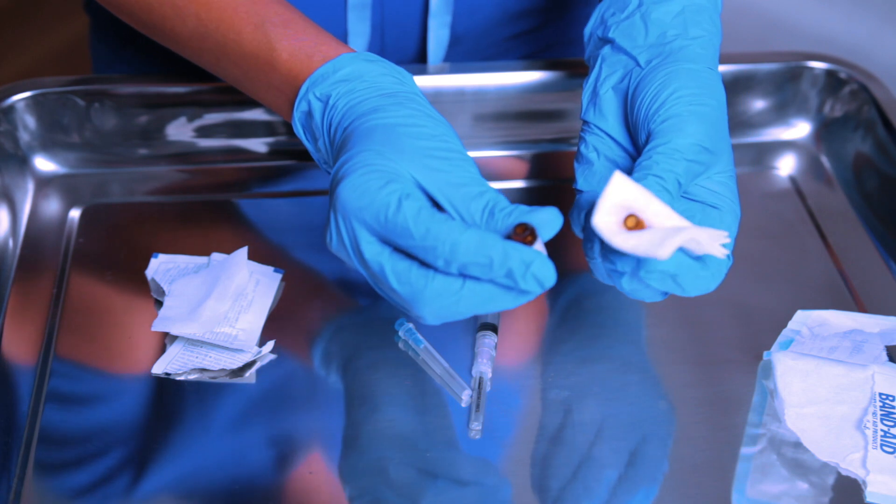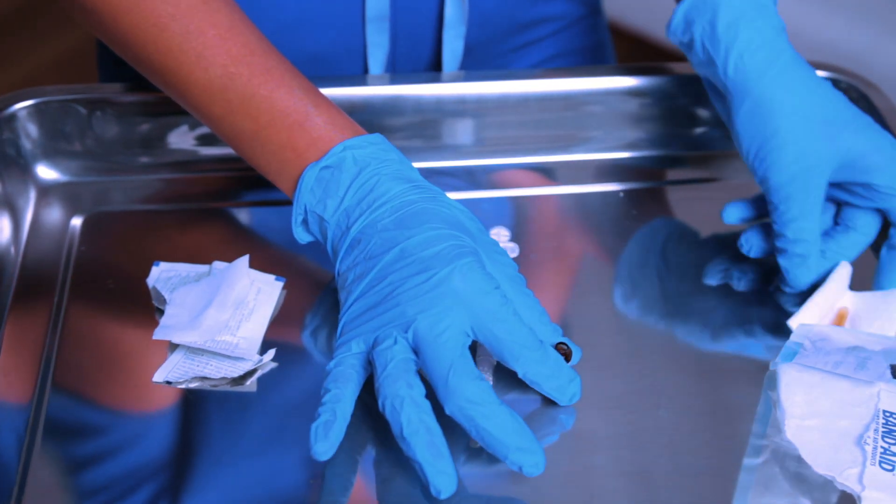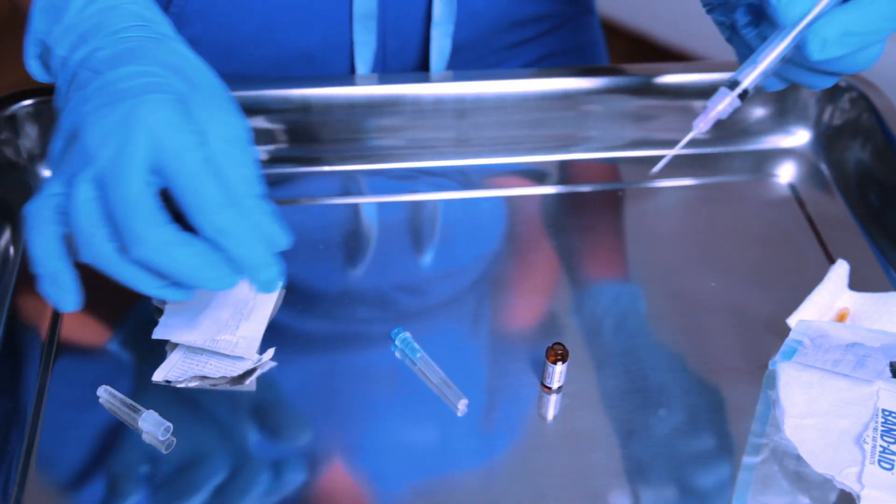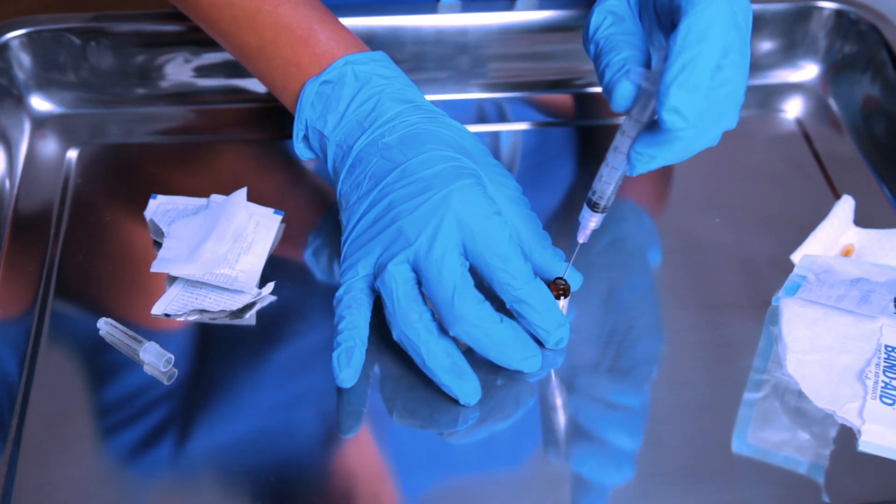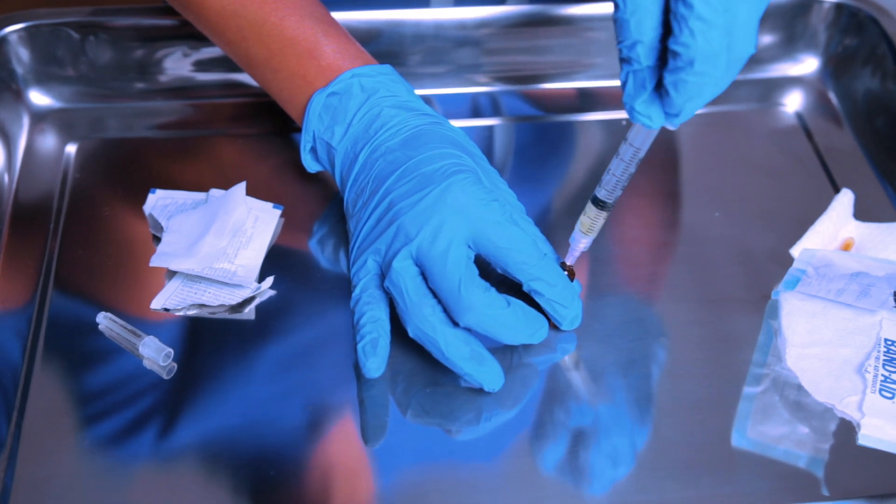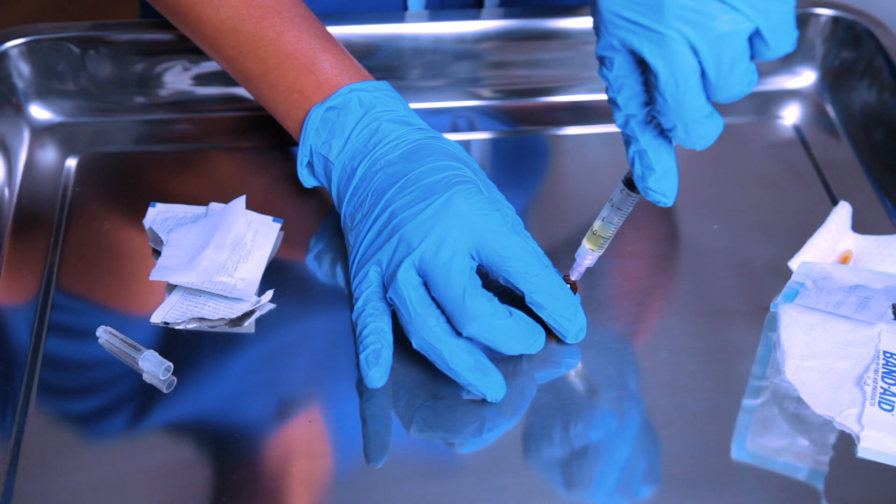So now it's two pieces, this is going to go in the sharps container, this piece, and then this piece is going to stay here. Now you can collect the medication. So you're going to remove the needle or the cap from the filter needle, you're going to hold the medication, and then you are going to draw up the medication. And in this situation, it should be about 0.5 mils.